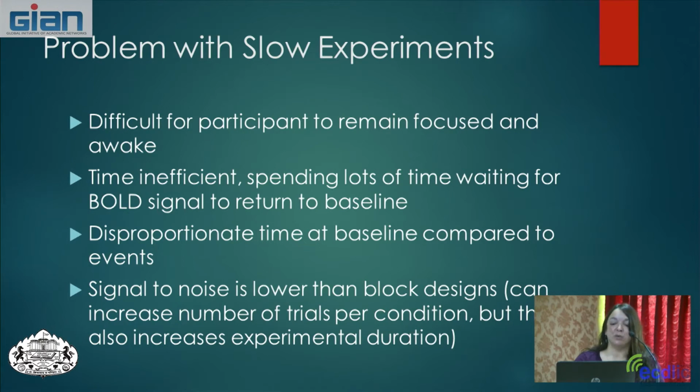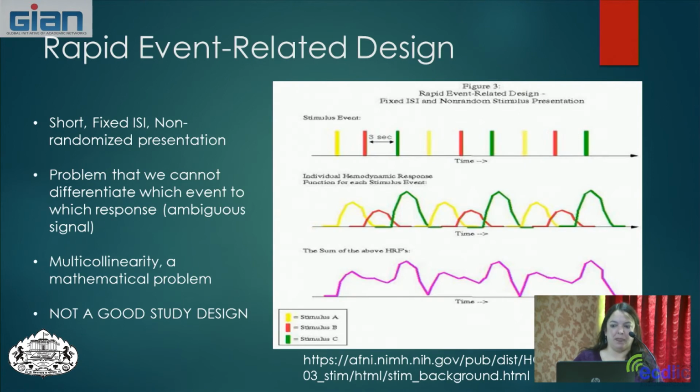Because of this, we can increase the number of trials per condition, again having them do it over and over again to get better statistical power. But again, if we have to wait for the BOLD signal to come back every time, this is going to be a long experiment for the participant.